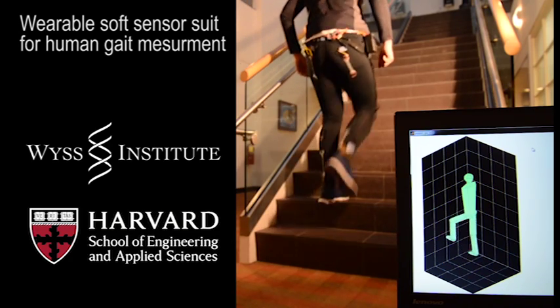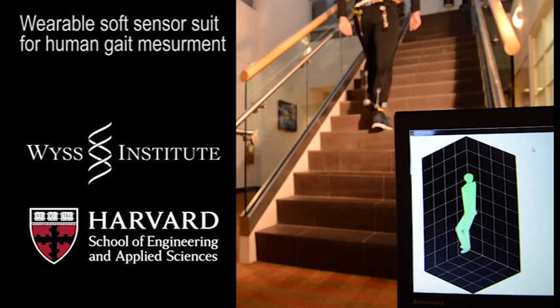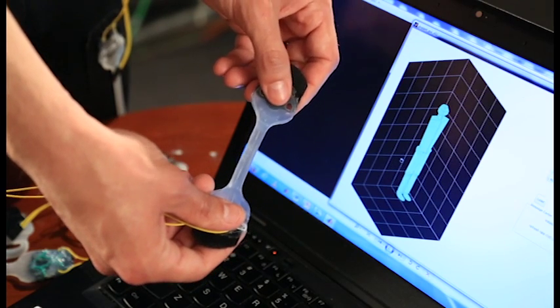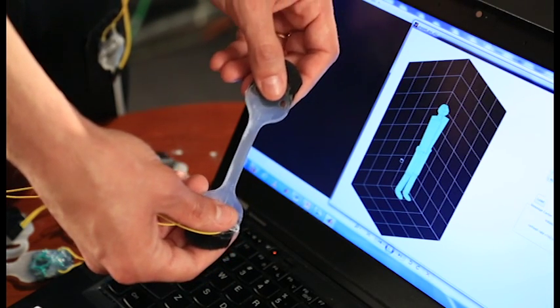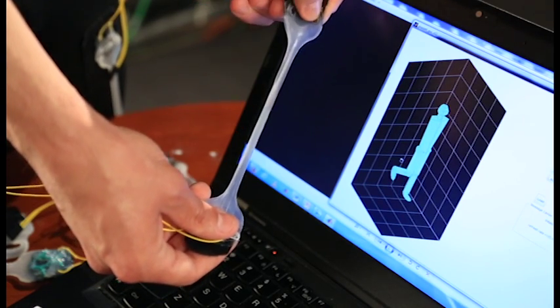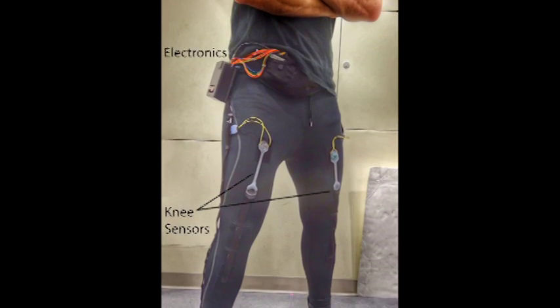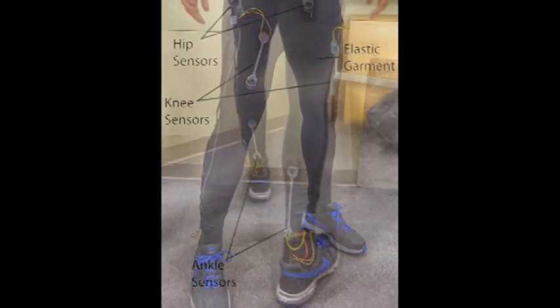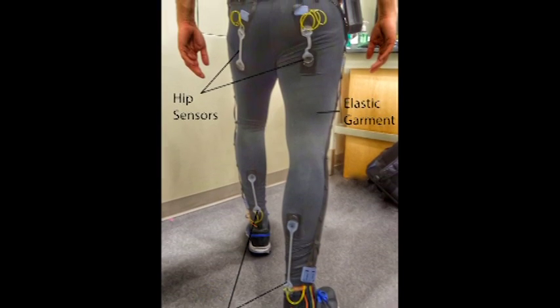We have created a soft sensor suit that measures the motion of the person wearing it. The key technology here is our hyperelastic liquid metal and elastomer sensors that measure the strain as a change in electrical resistance. The soft sensor suit represents the culmination of work that integrates our unique soft sensors into a lightweight and comfortable garment.